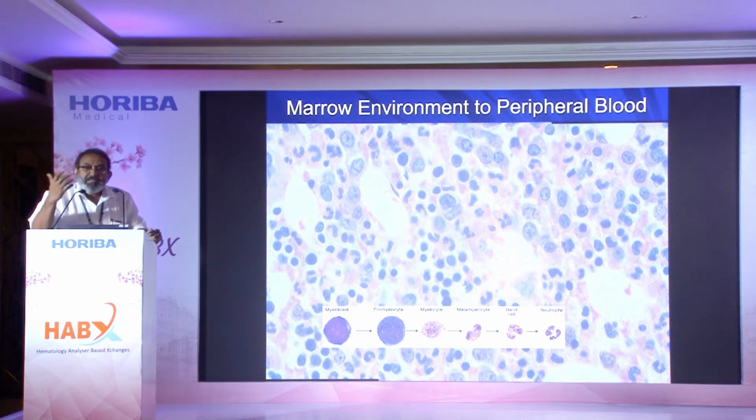Only thing is, the granules are there. Only thing is, they do not get stained because there is no sialic acid on the surface. So gone. The granules are there, but they don't get stained. So it's purely a staining mechanism. And then the fourth mechanism is that the size of the myeloblast becomes half. So 4 mechanisms happen during the time the myeloblast becomes a neutrophil.